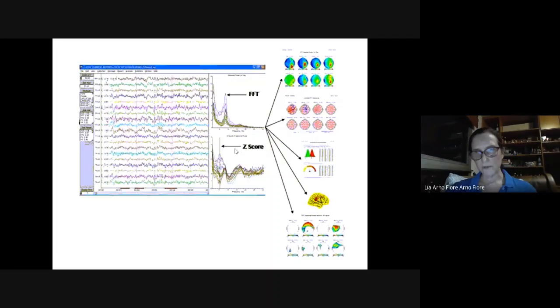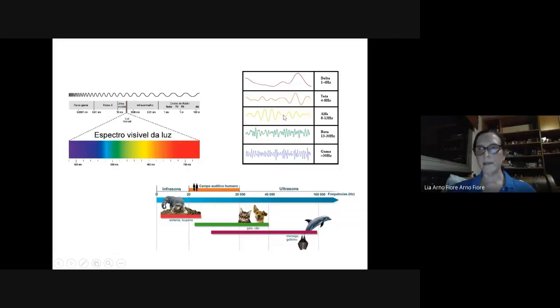What's important about having a digital collection of data is that, like everything, we always have a spectrum that we can analyze. I can see the difference, but if it gets too close, I won't be able to see it. Or if it's too slow, I won't know if it's half, 0.75, or whatever. These little nuances can only be seen when you use a digital collection.